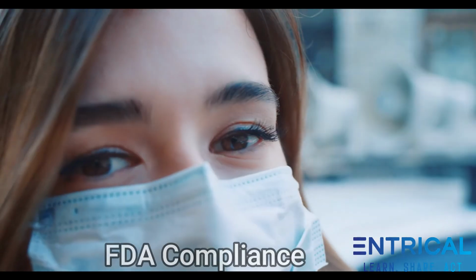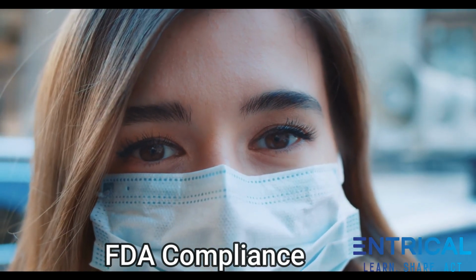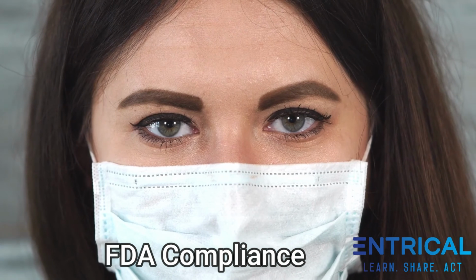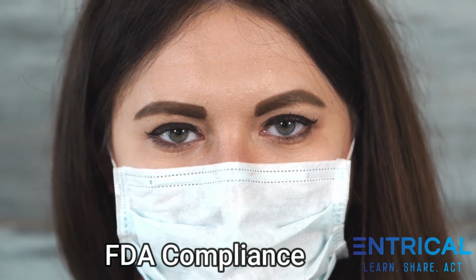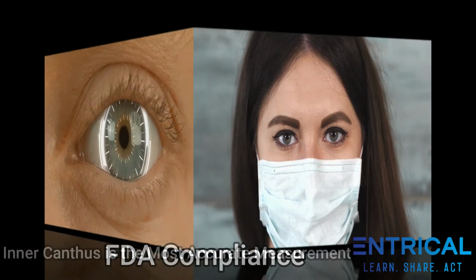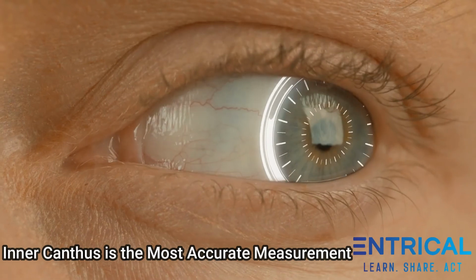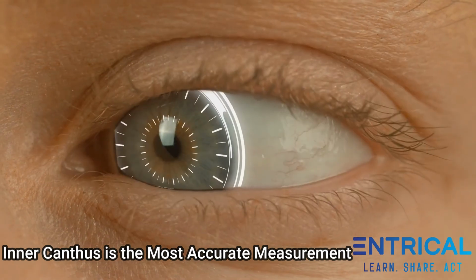It is also essential that the person faces the camera straight on and removes any facial or headgear such as glasses, hat, hair, or anything else that obscures the eye area. Keeping the eye area free from accessories is important because the inner canthus is the most accurate way of measuring a person's internal body temperature.